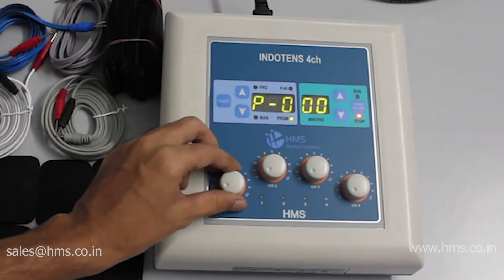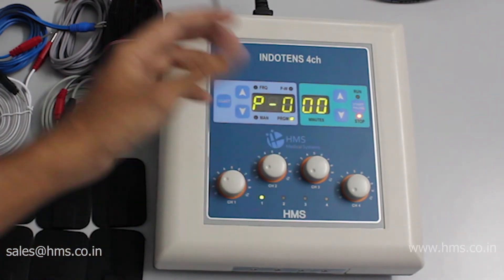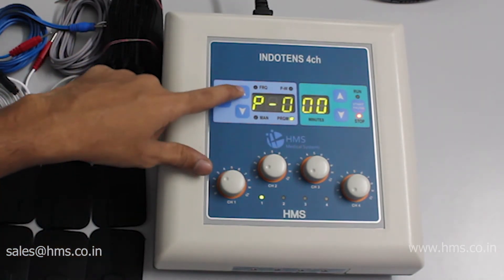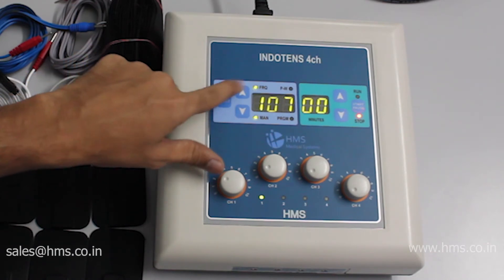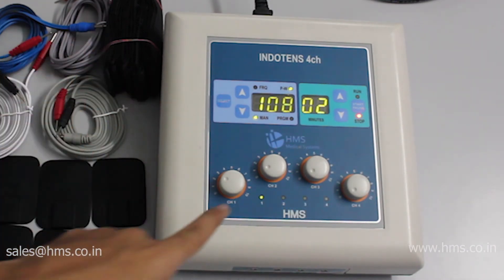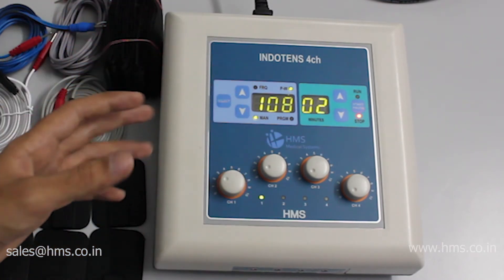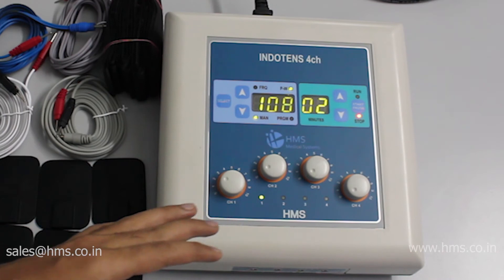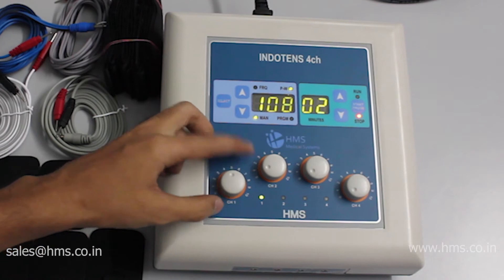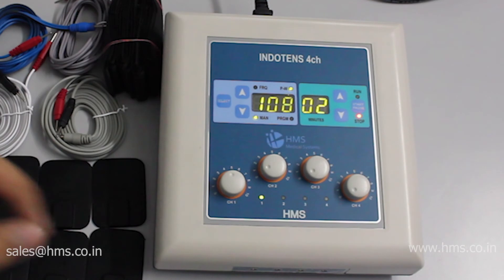Now I'll demonstrate a safety feature. If a channel intensity knob is left in the on state after treatment and you try to start the treatment again, the machine won't start. It will beep to indicate that one of the knobs is in the on state and the treatment cannot restart. This prevents a sudden surge of power to the patient when the intensity knob is at a high level.